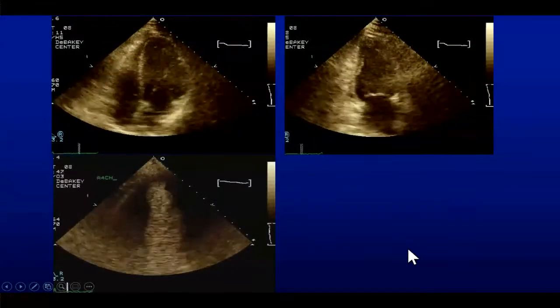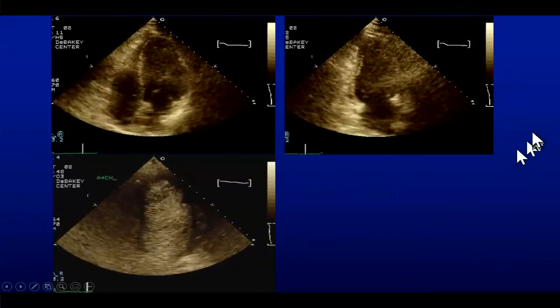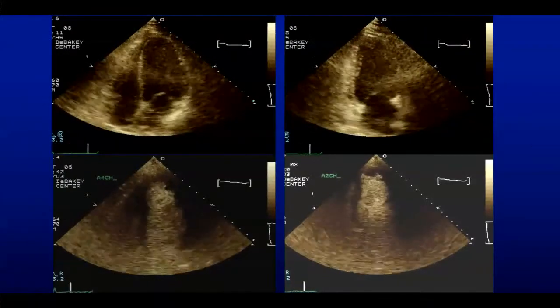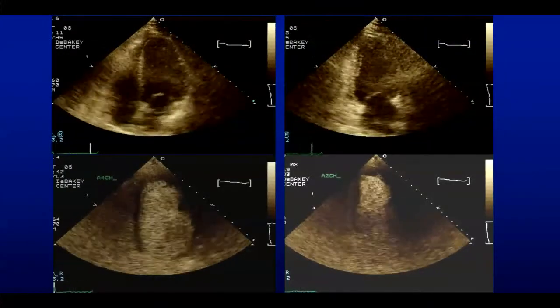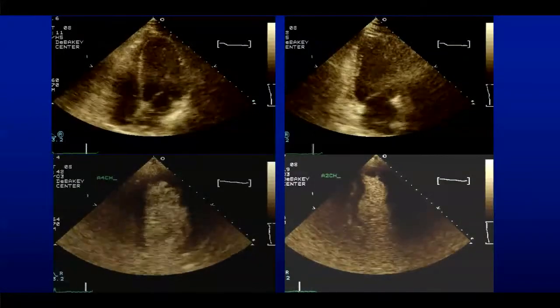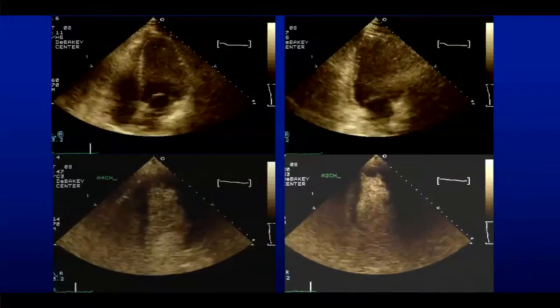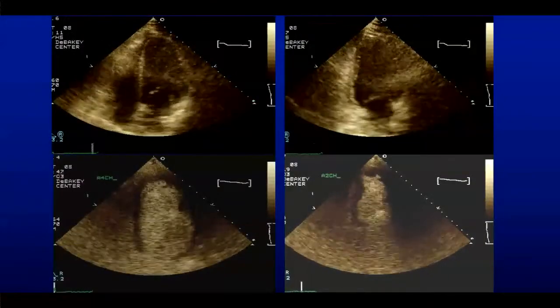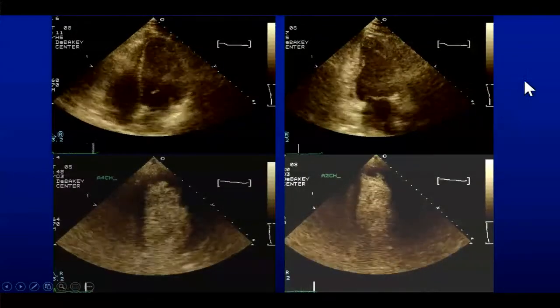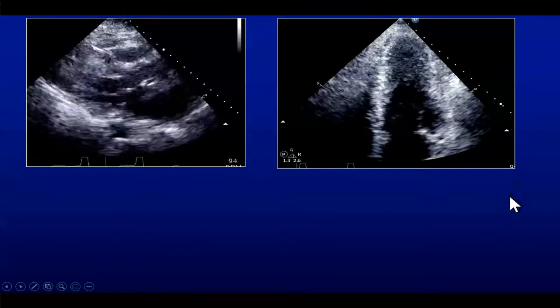Indeed, an apical abnormality, and on top of that, a thrombus in the apex. All right. It speaks to this: I want to see so I can diagnose. And if I can't see it well, I cannot diagnose it to the best of my ability, right? So I think this is where appropriate use of contrast would be important. All right, take a look at this case.